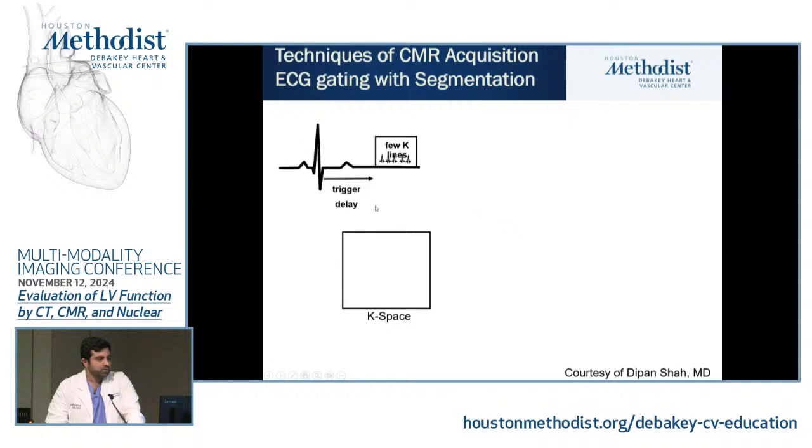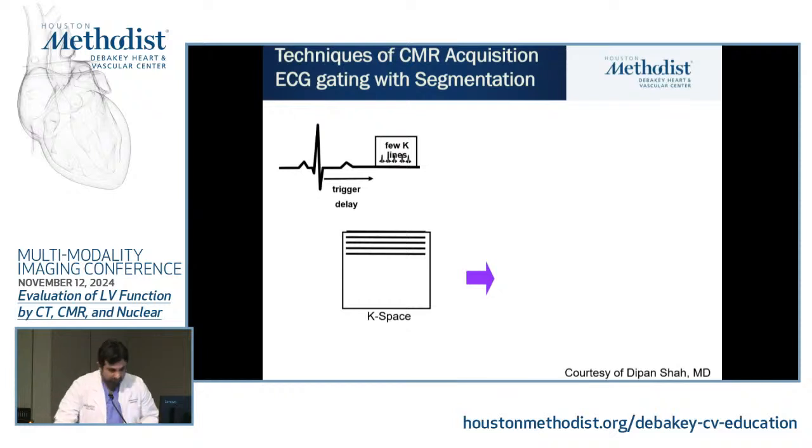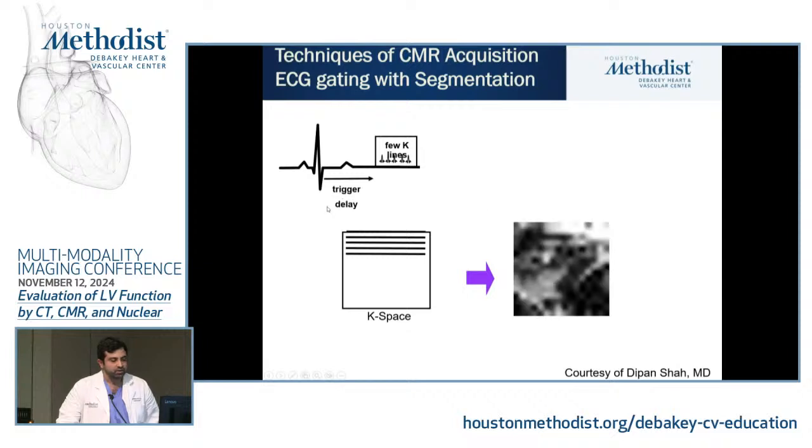So in terms of how we acquire this, it's a little bit different than CT, where the actual imaging data is acquired as K-space lines into what's called the K-space. And that's kind of like a canvas of frequency information rather than actual images. So MRI is generally considered a slower technique to acquire than CT, let's put it that way. So you need to get K-space lines through the RR cycle, and then let's say you want to create one image.